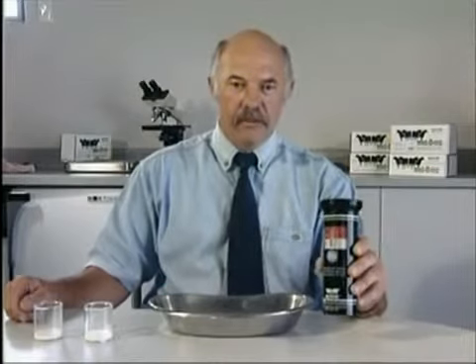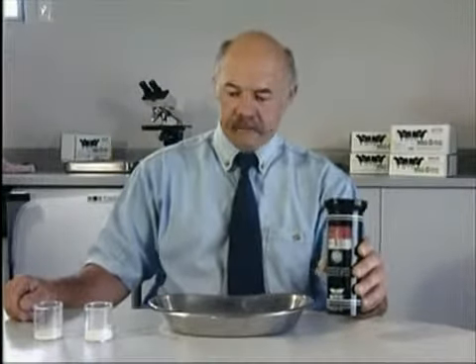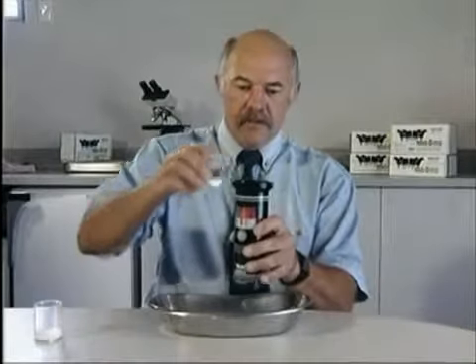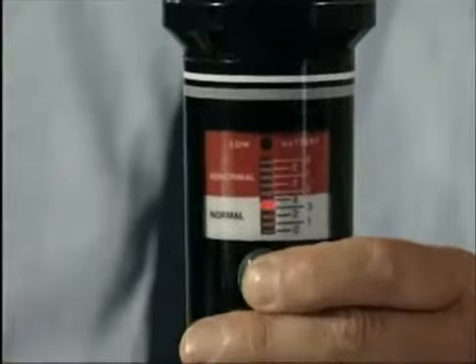It is so quick and simple to use that it is possible to protect your whole herd during milking. You simply squirt a few mils of milk in the top here. Any excess runs out the bottom.